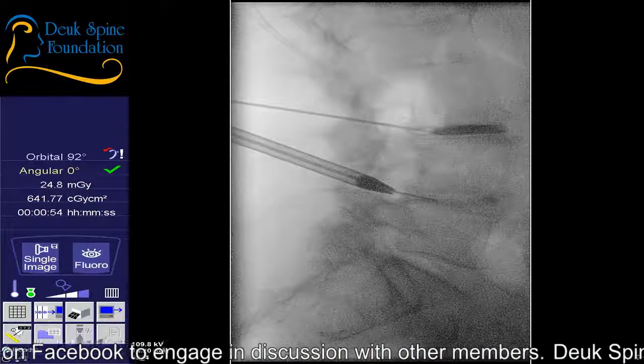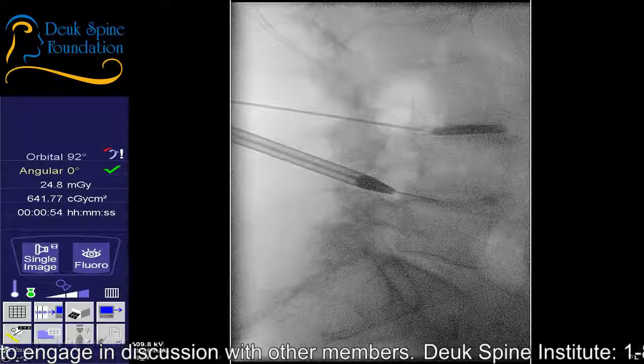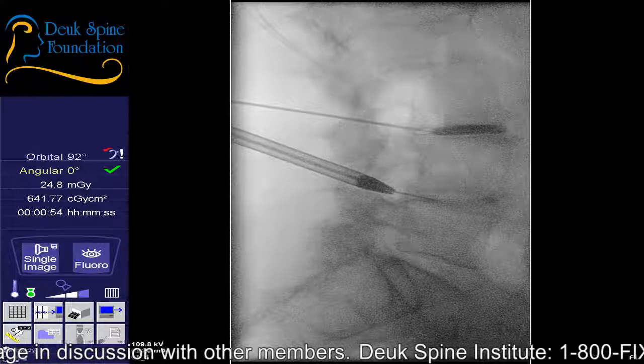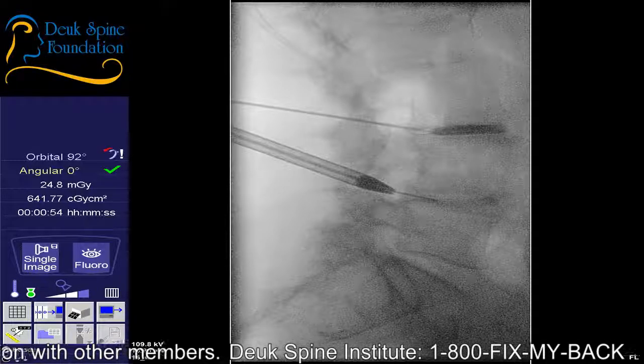Now I'm feeling the herniation right now with the tip of this metal pencil called the dilator. I feel the herniation right there. I'm pushing against it. It's hard. And that's the herniation that's pushing on the nerve root.